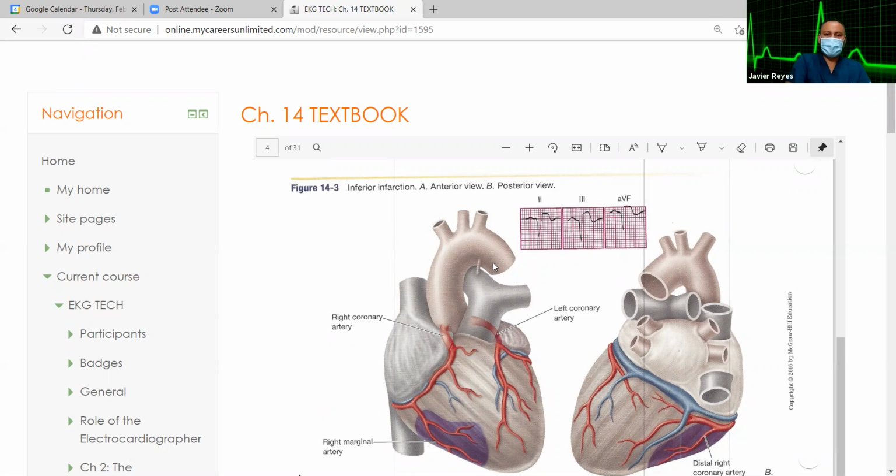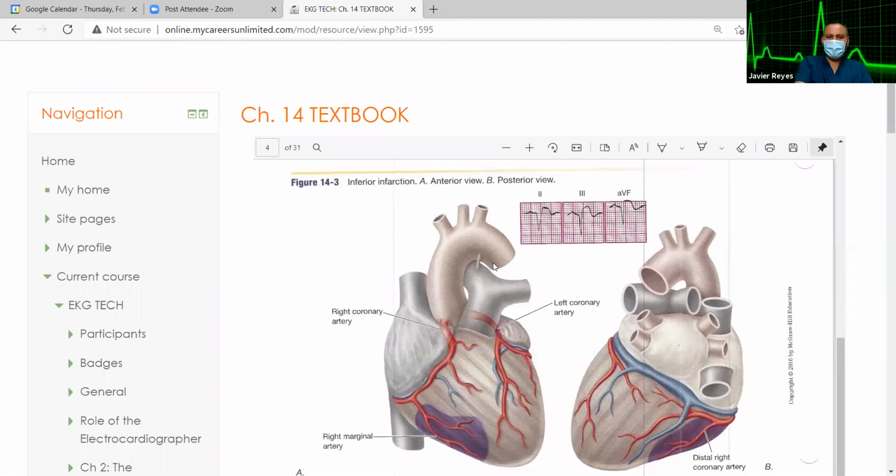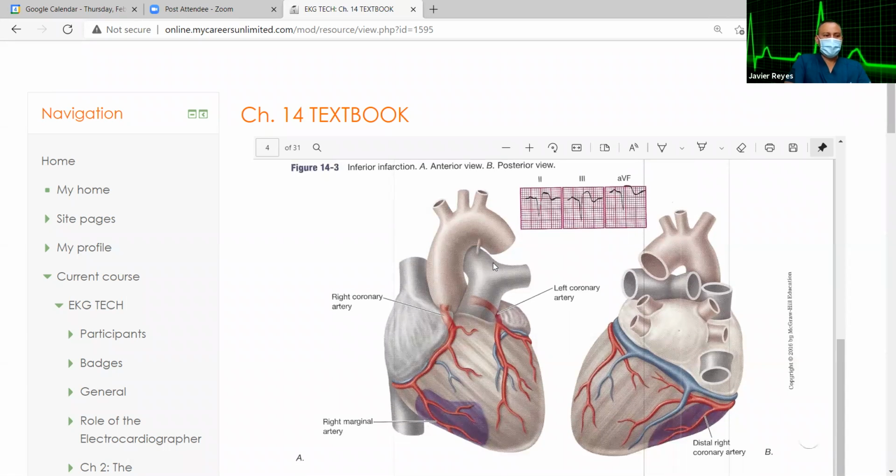Where is the heart attack happening? Where's the inferior part of the heart? Inferior means what? Low, on the lower part of the heart, the lower muscle. For being one of the ventricles? Yes, because it's in the lower right.